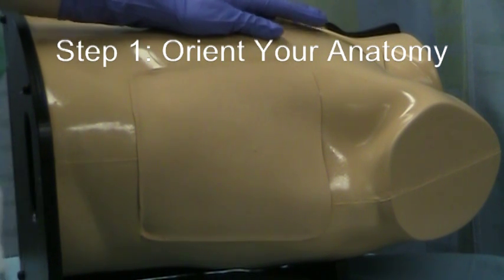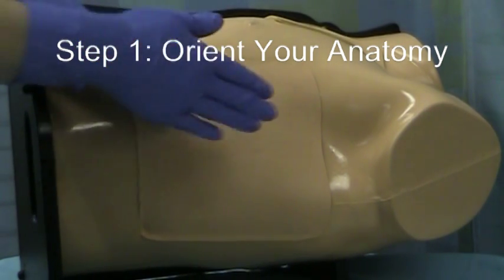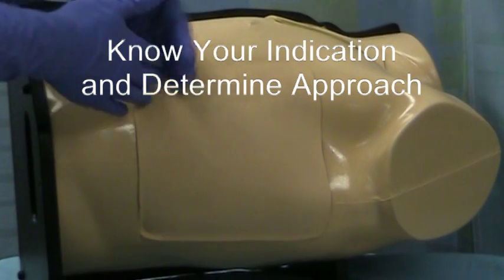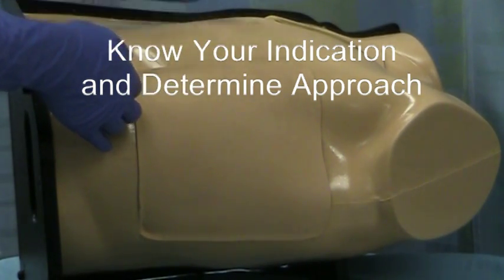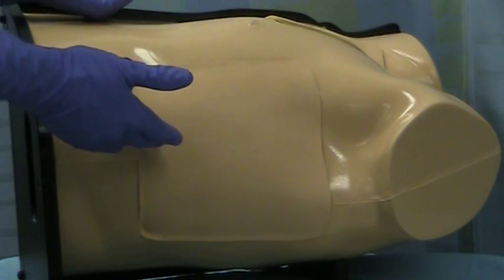Alright, so when placing a chest tube, these are the anatomy things that we look for. Obviously, we're placing the chest tube into the patient's chest cavity to relieve some sort of abnormality, be it air from a pneumothorax, tension or simple, or maybe fluid or blood has built up from various processes.